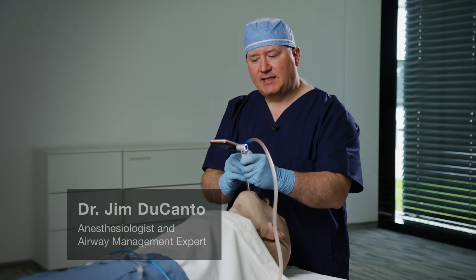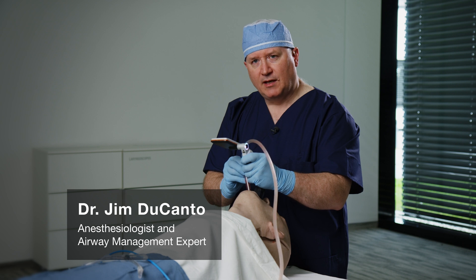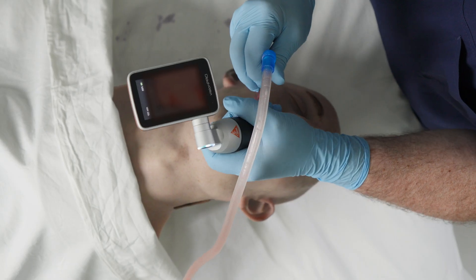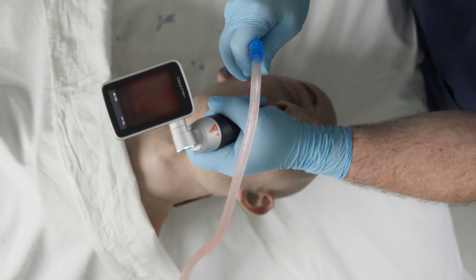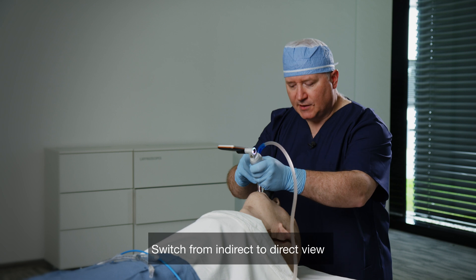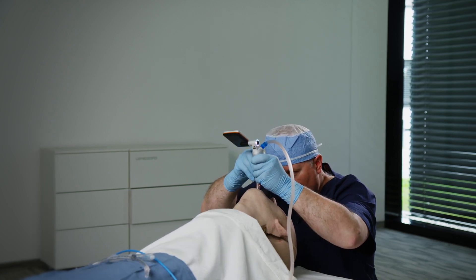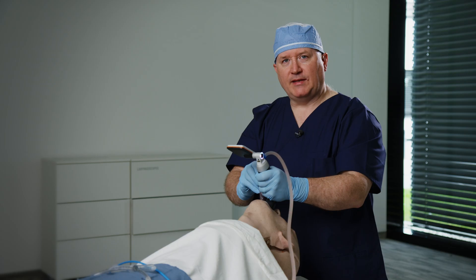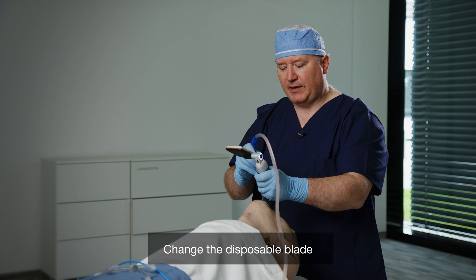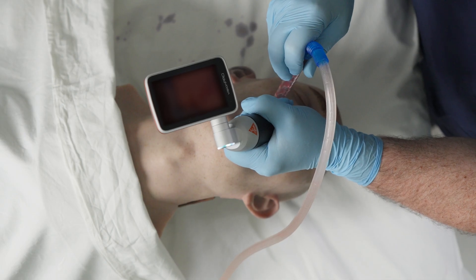Should the optics become contaminated either because I'm not aggressive enough with suctioning or because of a spurt of airway contaminant, I have another choice with this particular device. It is a Macintosh shaped video laryngoscope that does permit direct laryngoscopy. I'm looking at the larynx now, I'm looking at the posterior commissure, now I have a grade one view. Should I have soiling of the optics beyond direct laryngoscopy, I can very rapidly change the blade using a disposable system.